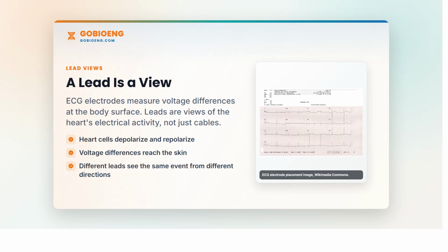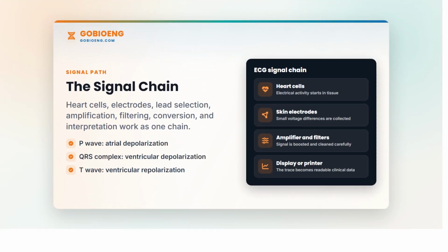The 12-lead ECG is one of the most important clinical formats. The name can confuse beginners because a routine 12-lead ECG commonly uses 10 physical electrodes: right arm, left arm, right leg, left leg, and 6 chest electrodes. The machine then uses electrode combinations and calculated references to create 12 views. A helpful analogy is camera angles. One camera cannot show the whole object. The 12-lead ECG gives clinicians multiple electrical views of the same heart event. This is why lead placement and labeling matter so much.